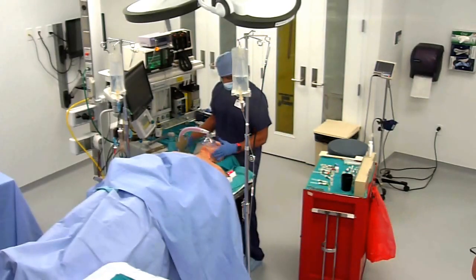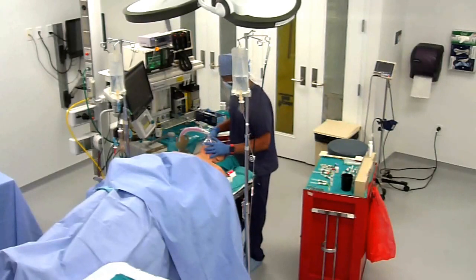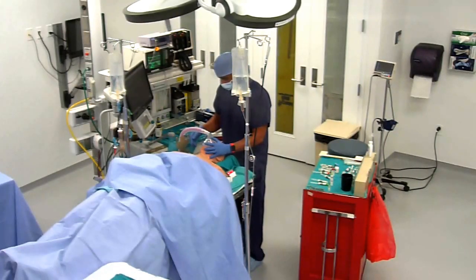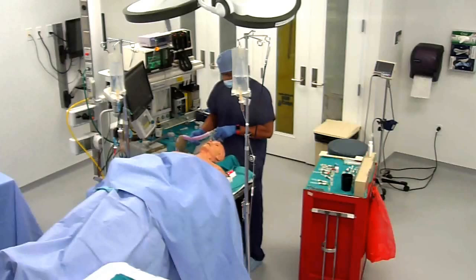Katie, how do you feel? Eyelash flick. No response. Okay, paralytic is on. So I'm going to go ahead and intubate. Another 7 mils, 70 milligrams.